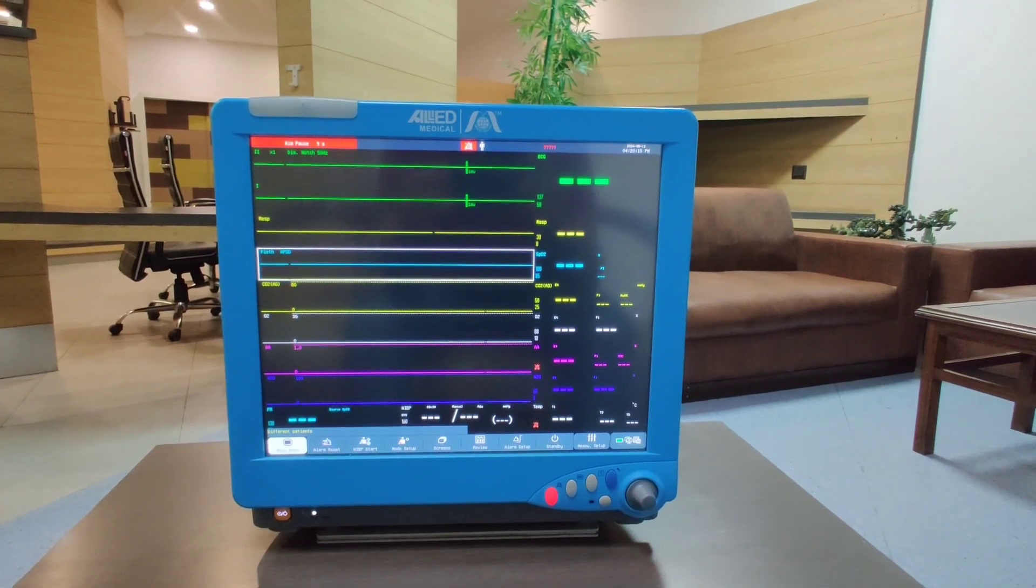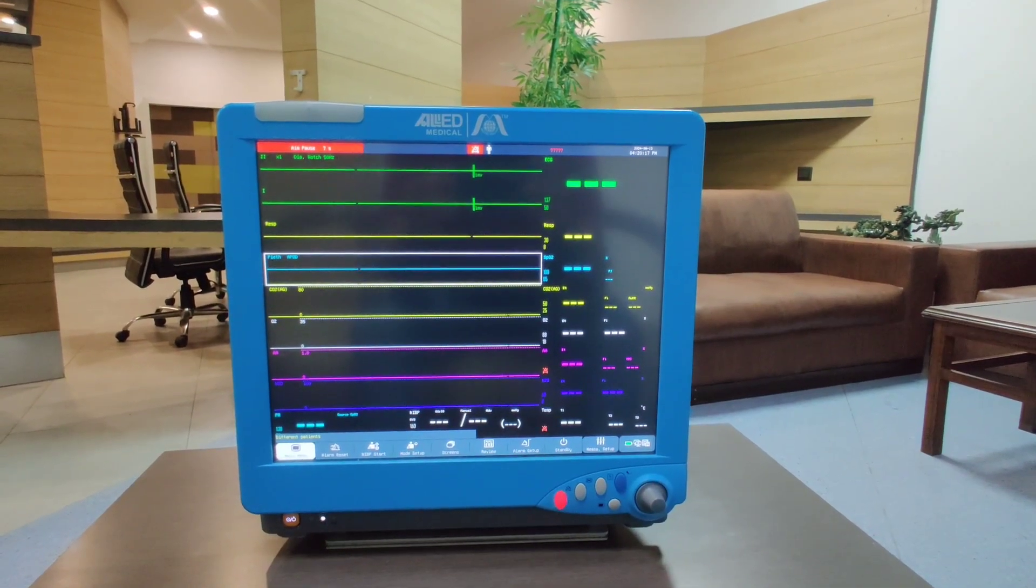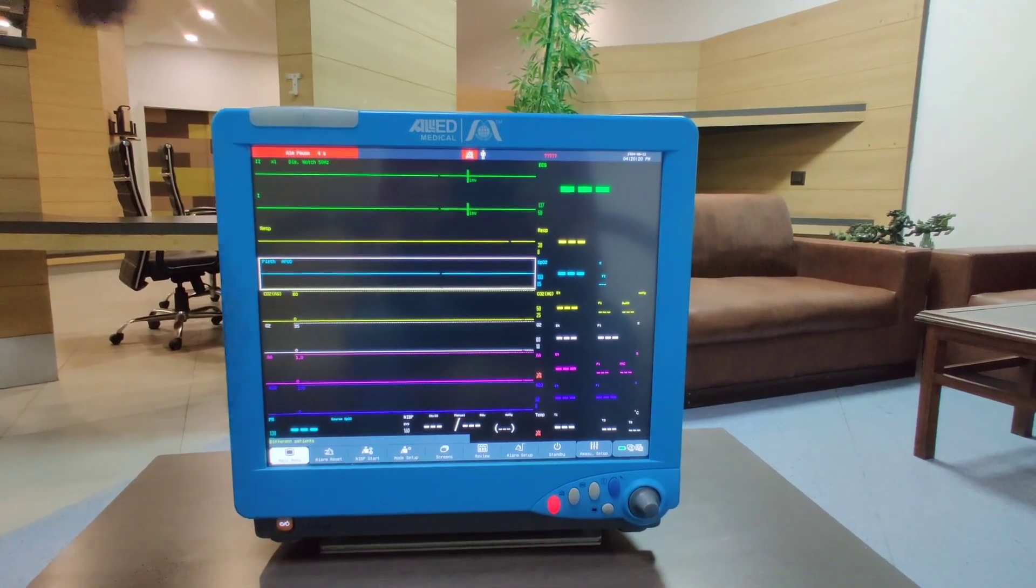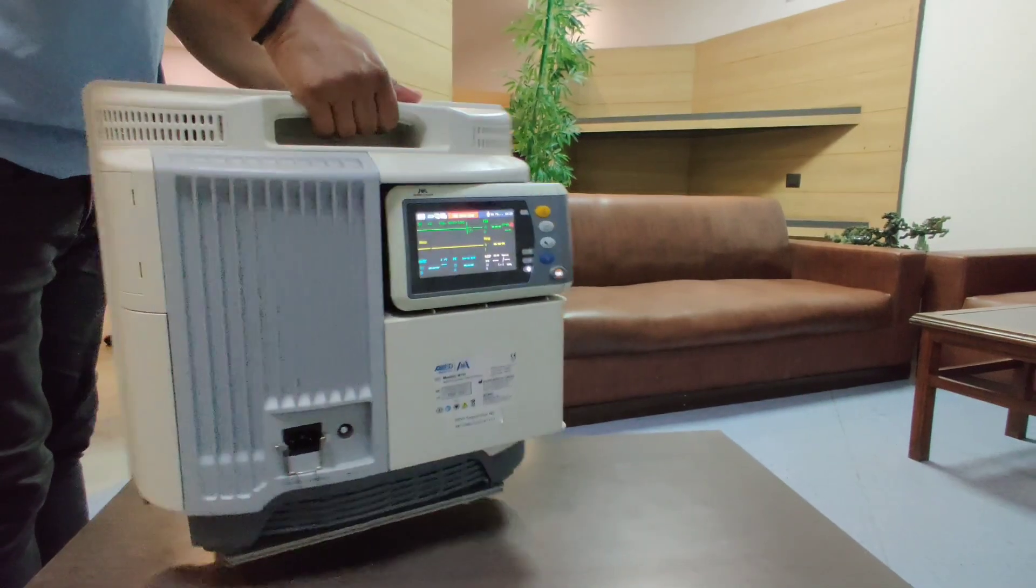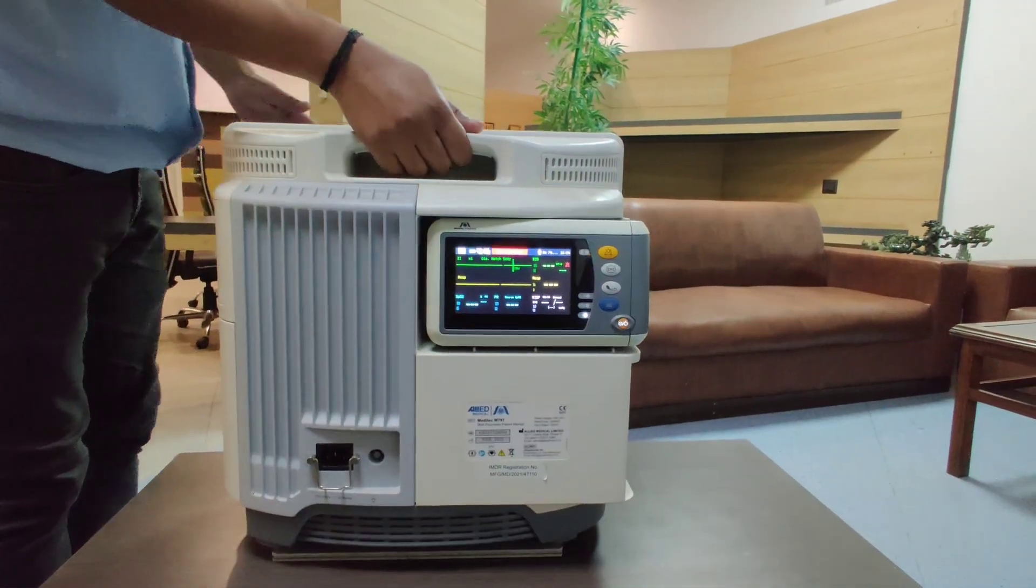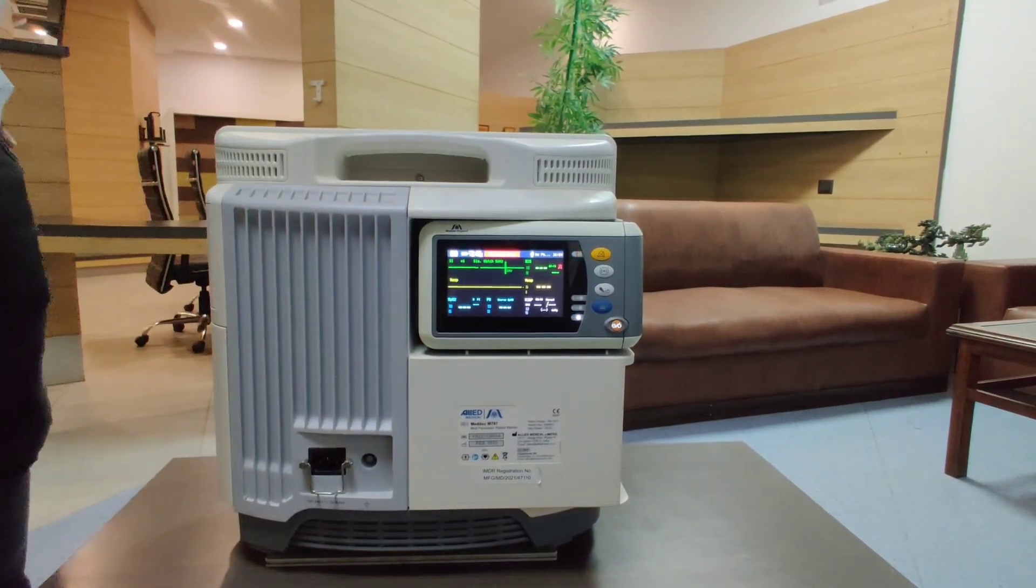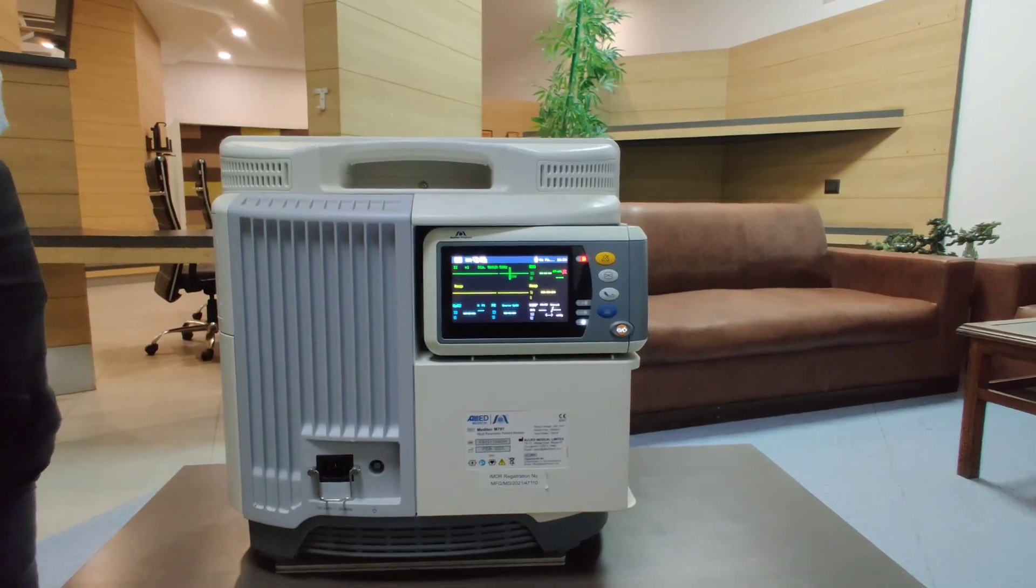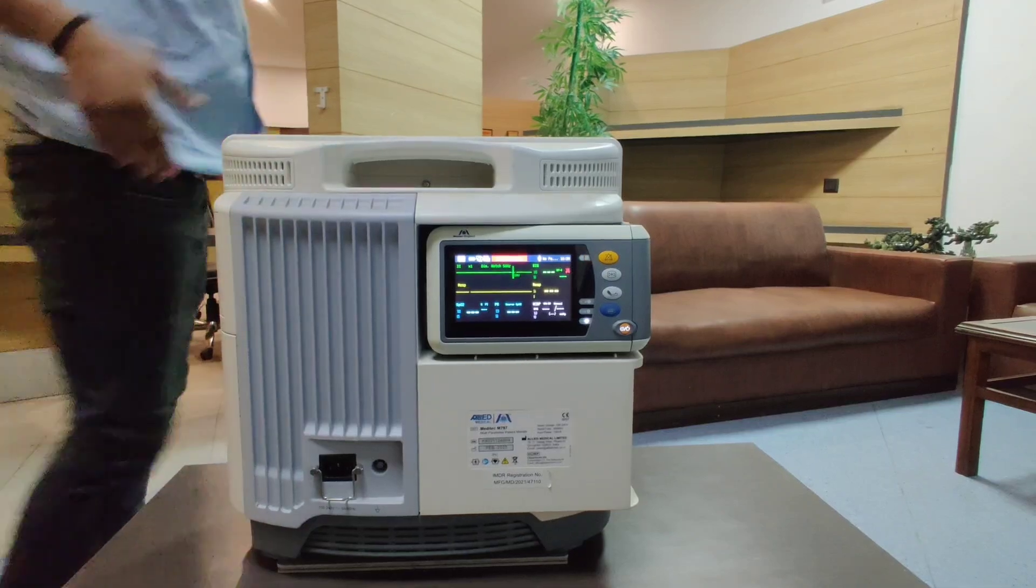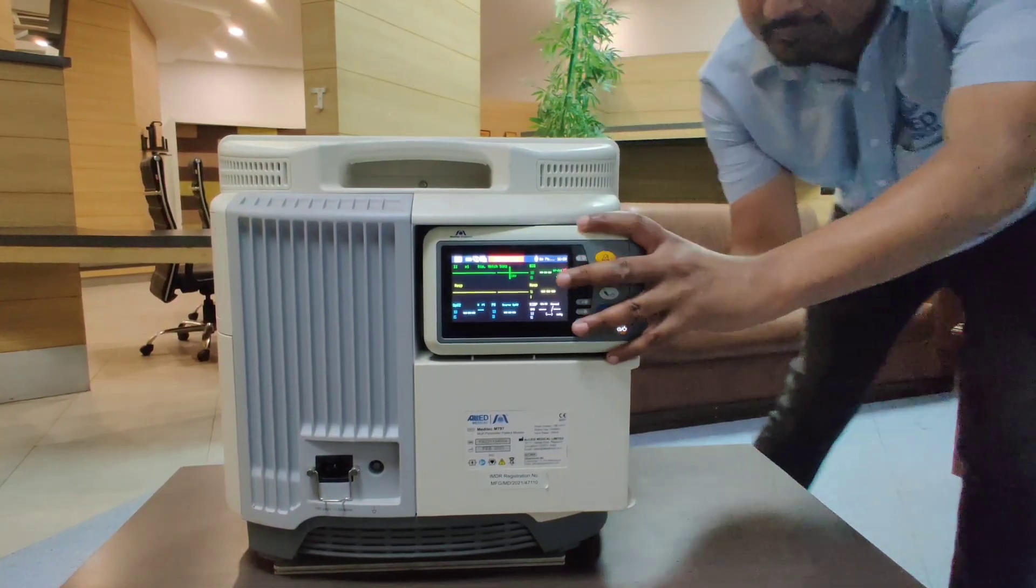Discussing the fully modular monitor, at the back side we have a transport monitor which measures all the five basic parameters. This small monitor can be easily detached from the monitor like this.